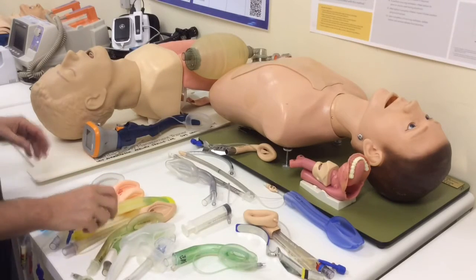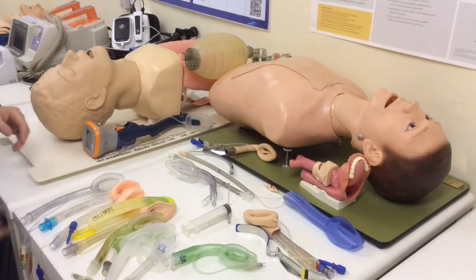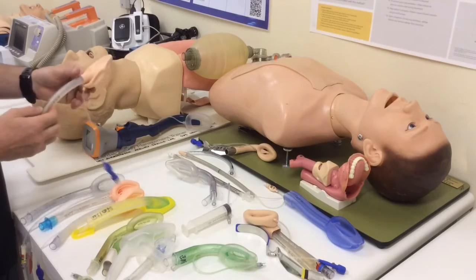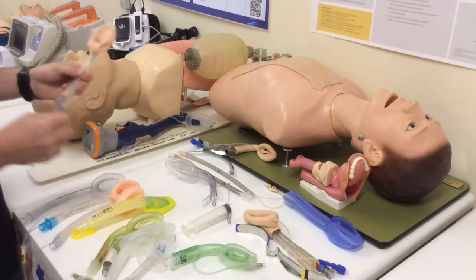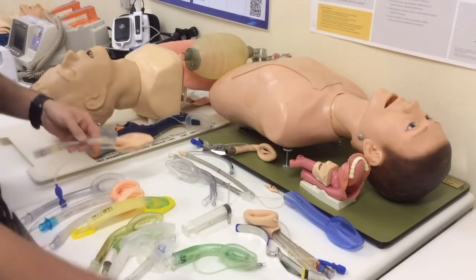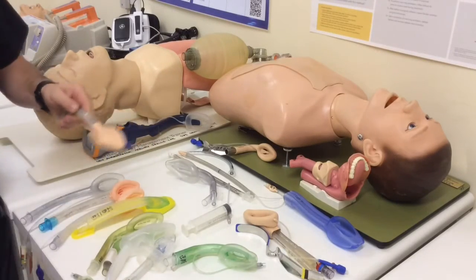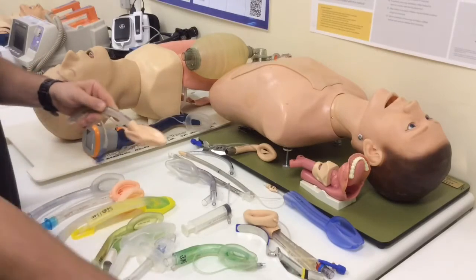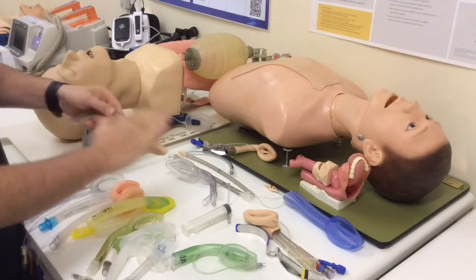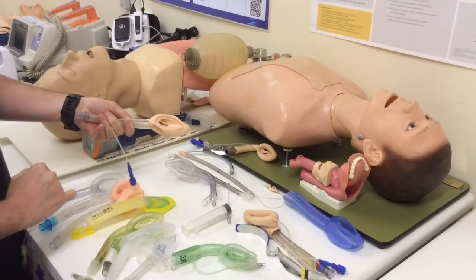Okay, so we've selected a device, we've selected a size, we know there's no obvious contraindication. How are we going to insert it? The most classic insertion technique, if we're using an LMA for instance, is that you deflate your cuff and apply a good quantity of a water-based lubricant. Obviously in plastic patients here I'm using a mannequin. Lubricant to the back of the device, with it in the sterile packaging. Make sure the lubricant is nicely spread in the back of the device. Avoid getting it into the bowl of the device.